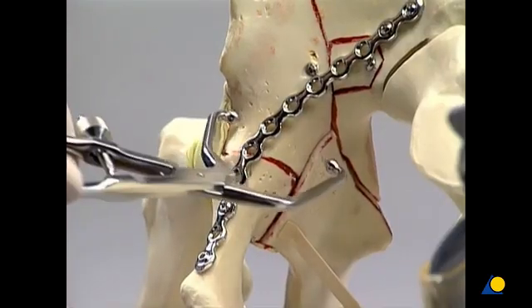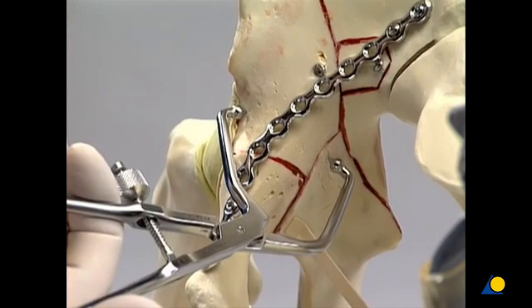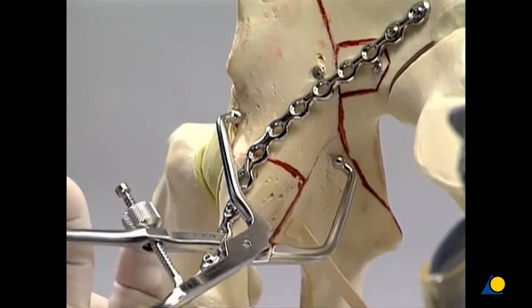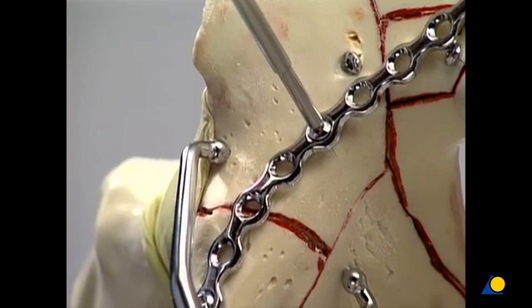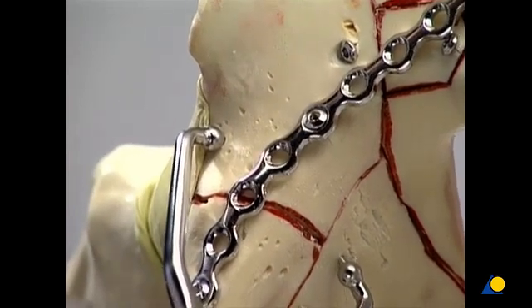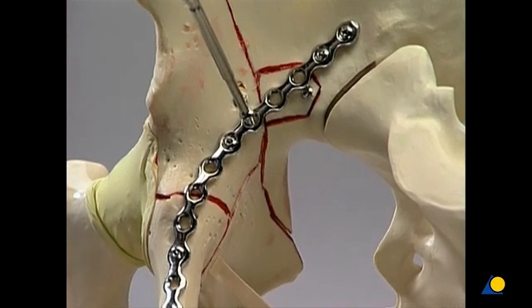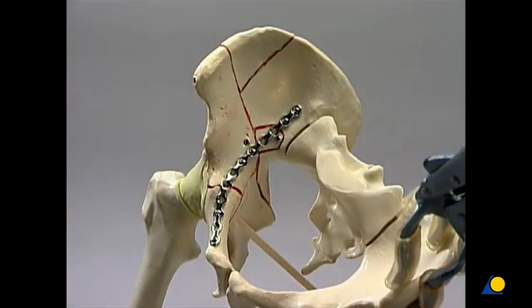The large angled reduction forceps is introduced. The short arm is placed through the second window and the long arm through the third window. The forceps is applied from the pelvic brim to the quadrilateral surface. The posterior column is reduced to its correct position and fixed by inserting a lag screw through the plate directed towards the ischial tuberosity. The reduction forceps is removed. A lag screw is inserted through the adjacent proximal plate hole oriented in the direction of the ischial spine. It is not necessary to fill all the plate holes with screws. Screws must not be inserted through the plate holes in the area of the iliopectineal eminence so as to avoid the serious risk of penetrating the hip joint.